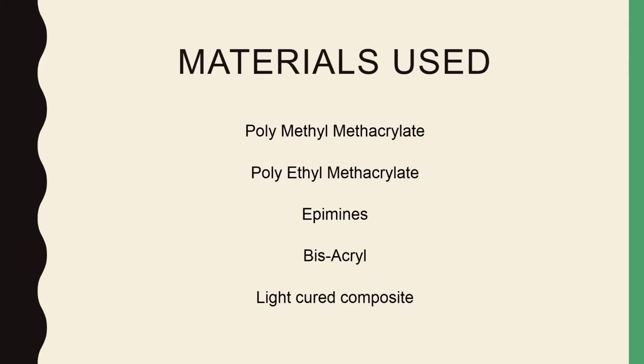The main materials used for making a provisional restoration are polymethyl methacrylate, polyethyl methacrylate, epimines, bisacryl, and light-cured composite.